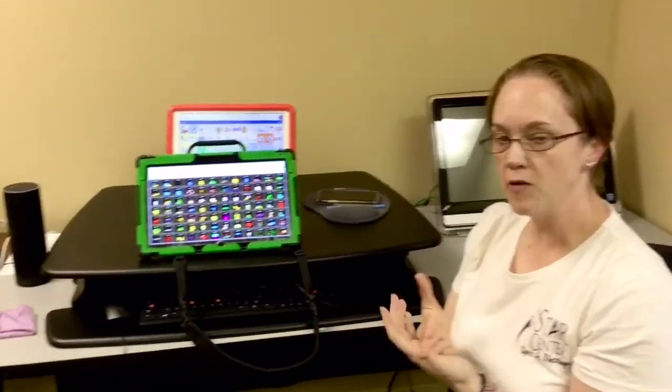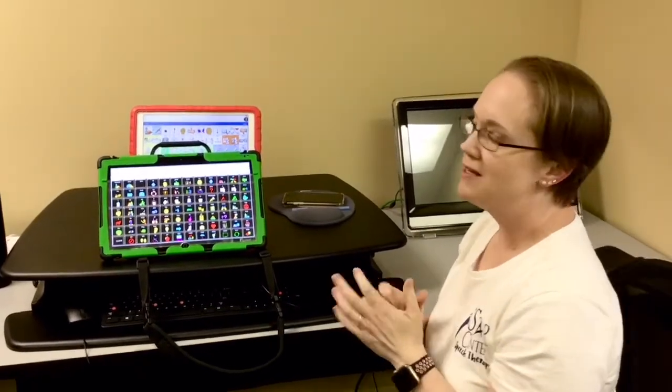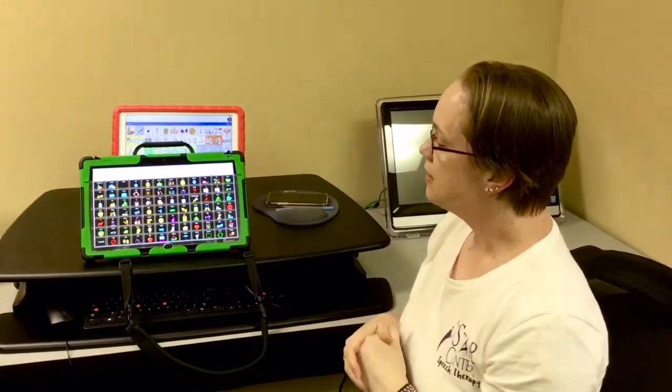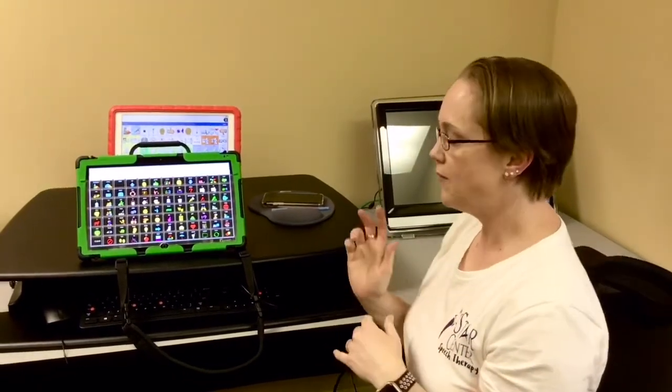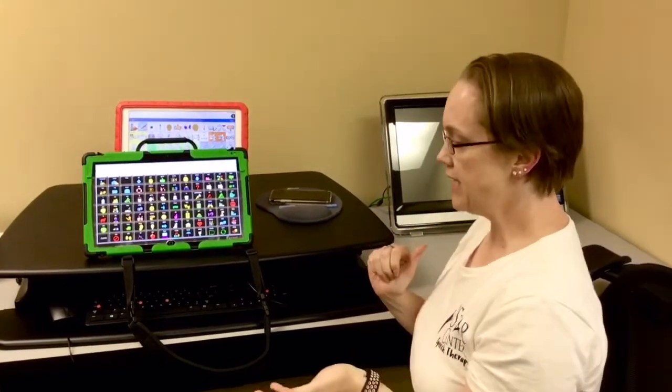All of that is really going to depend on client ability, what the client wants. There are some apps that we can put on cell phones. It's very limited, but it's getting better as technology advances. So all of those things are considerations that we have to think about for each specific client and each need.